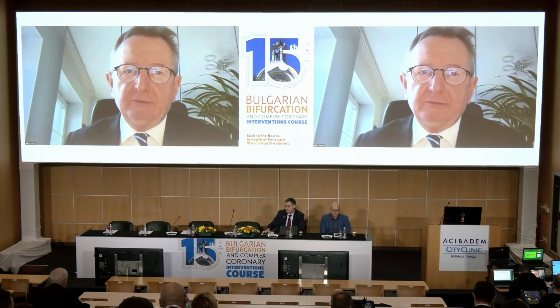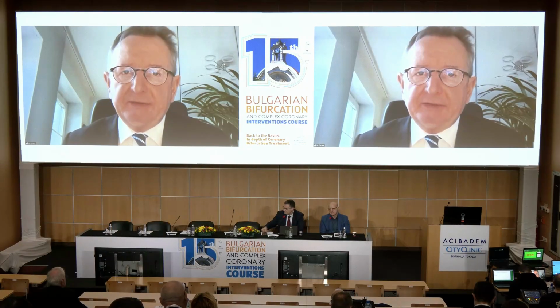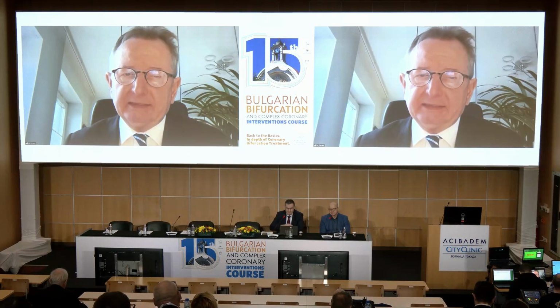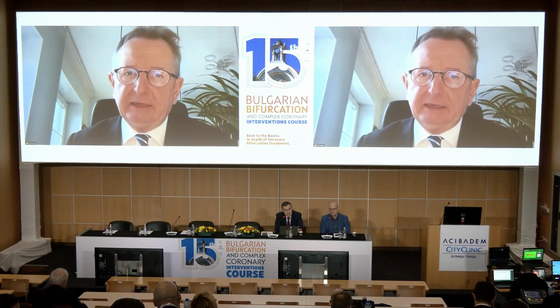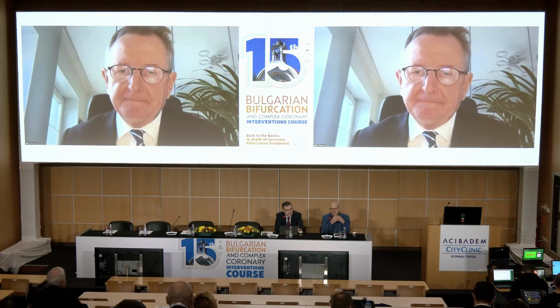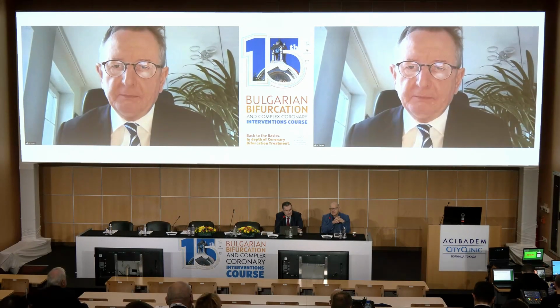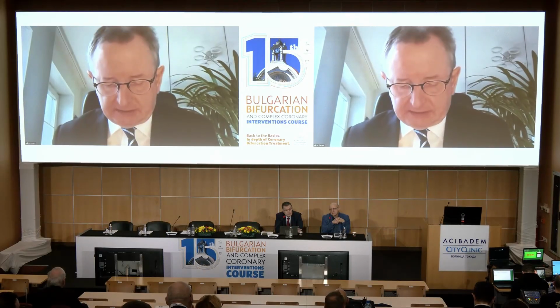And we go with a higher speed. We start with 175,000 and escalate after a few runs to 190, 200. This is usually very effective and safe. And what's the rationale to escalate up to this, let's say, from 170 to 190? What I can tell you is I can cross the lesion more safely.